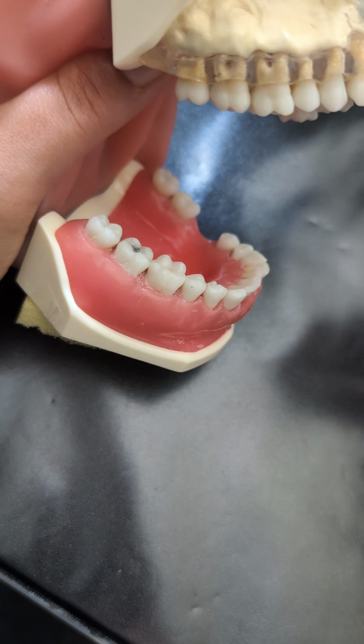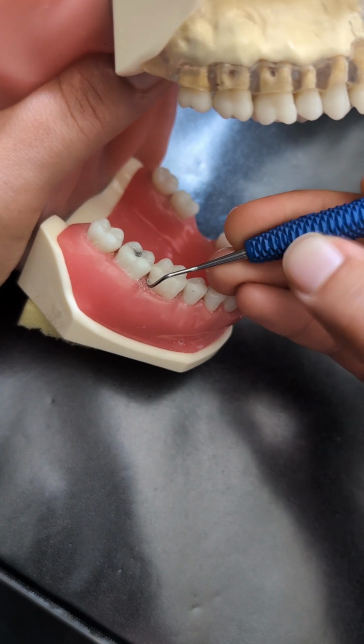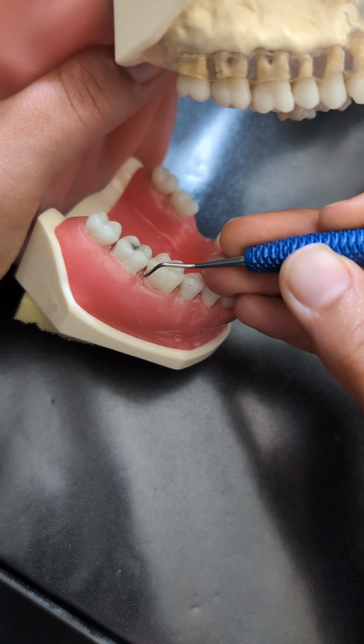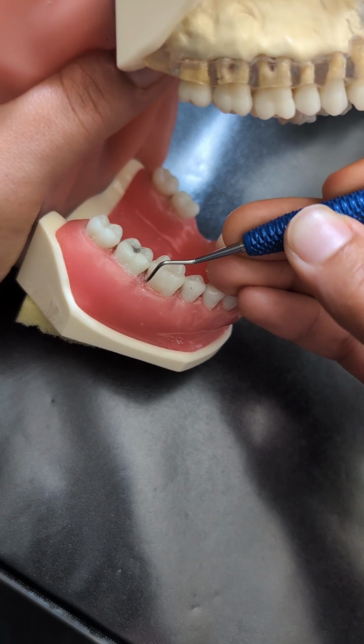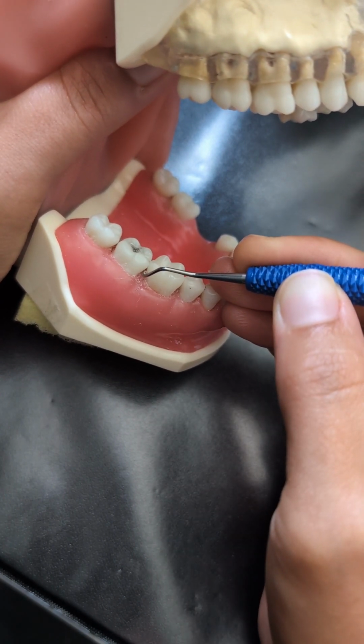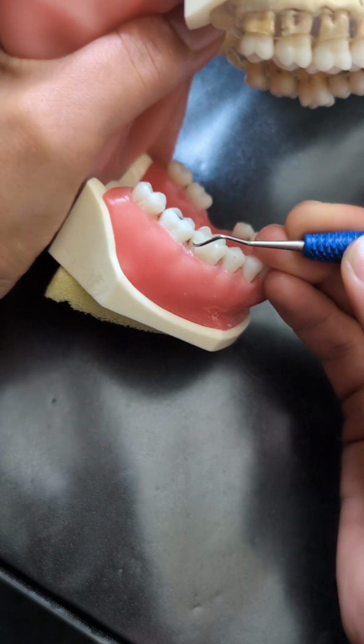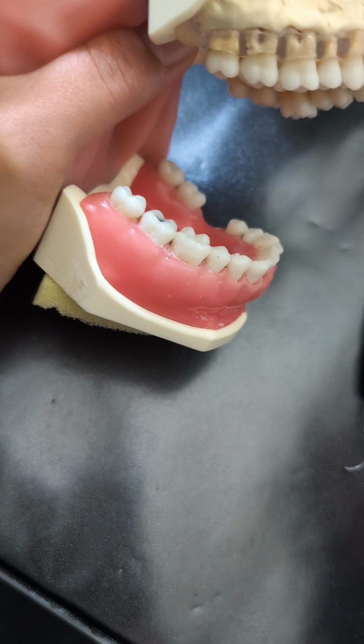It's not like with the universal, where the face of the blade is 90 degrees angled to the lower shank. So we have to create a working angle by slightly angling the instrument toward the tooth surface in order to activate it or scrape.